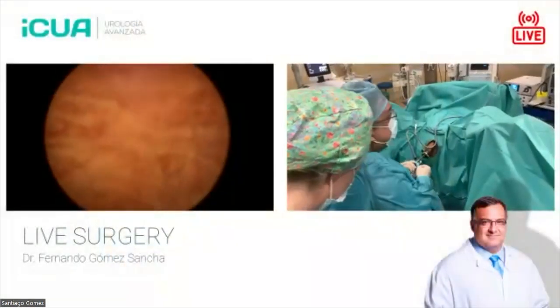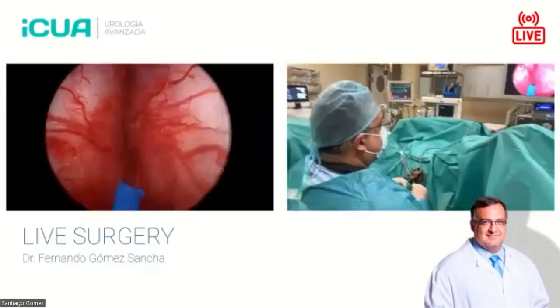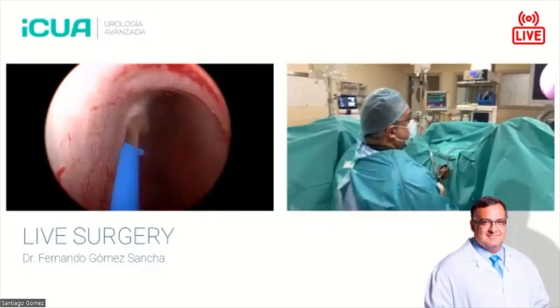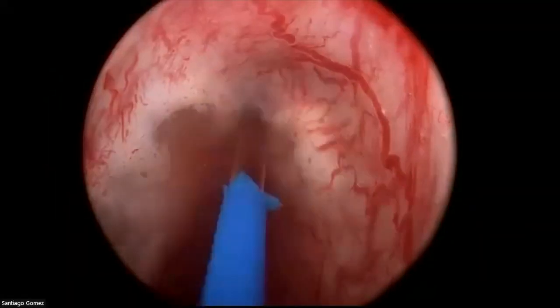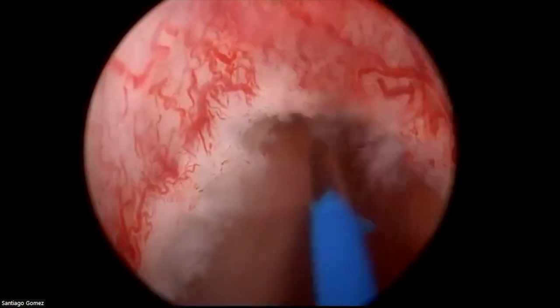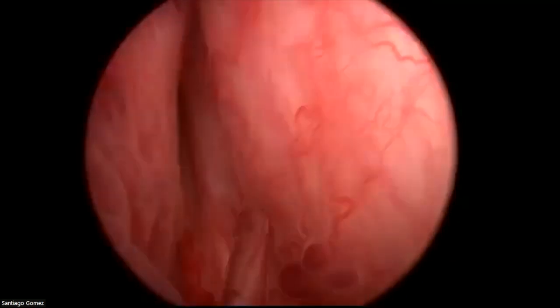So I'm going to introduce the fiber. Good. So here we are again, the veru, and here is the line. You see, I'm going to mark the limits of the dissection. This is the white line, and we'll try to make sure that the mucosa doesn't break due to traction, but we will break it where we want, you see. And here, if I come out, this is the sphincter, so we're quite safe.